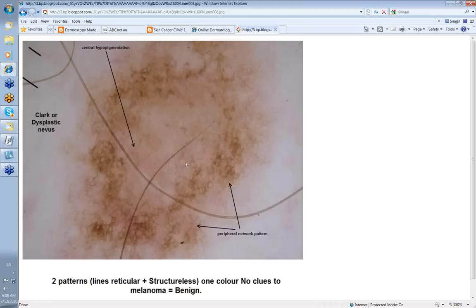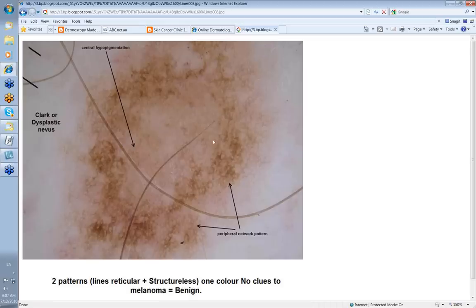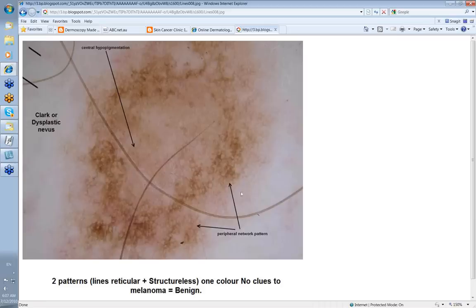What about this one? Here you've got two patterns — lines reticular, but they're very disrupted, not the same regular network as in a benign nevus. There's also a central structureless area. So you've got two patterns and one color, but there are no clues to melanoma. This is a benign lesion — in fact a Clark or dysplastic nevus — and this is quite a common pattern where you have a structureless central area and a peripheral network, albeit a disrupted one.